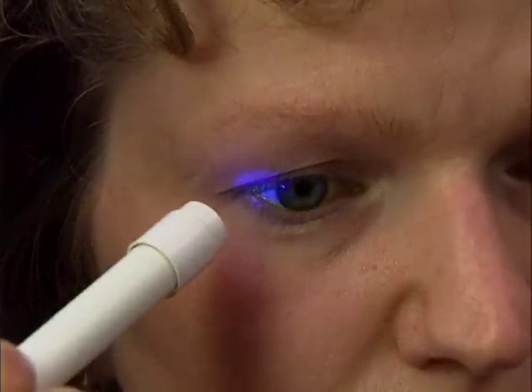Now illuminate the eye with a cobalt blue light, a pen light with a blue filter. An abrasion will show up as a greenish-yellow stain on the cornea.